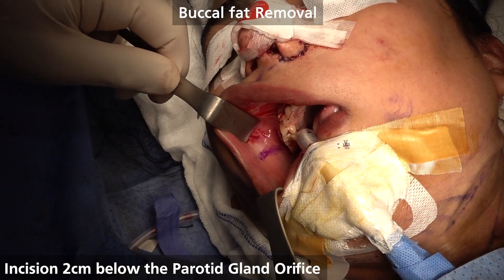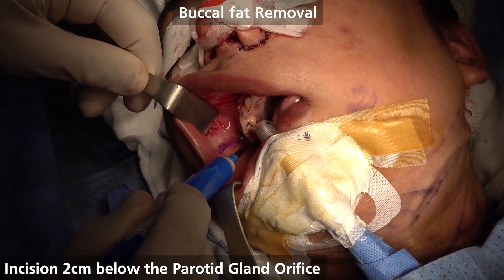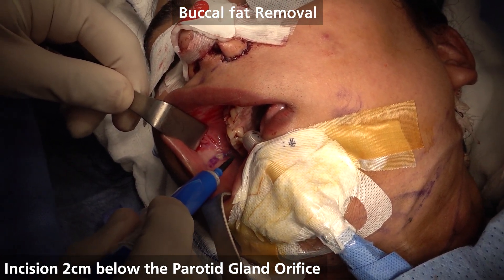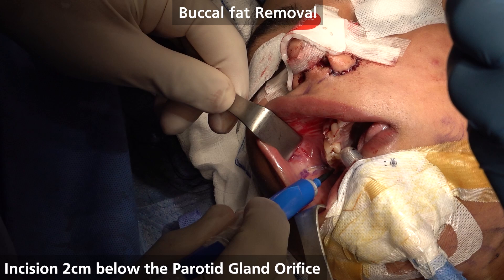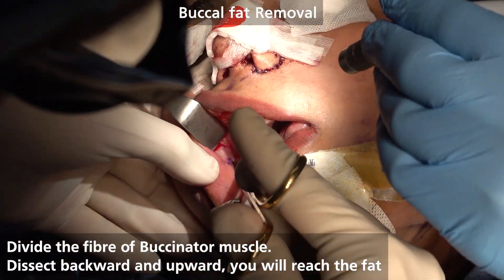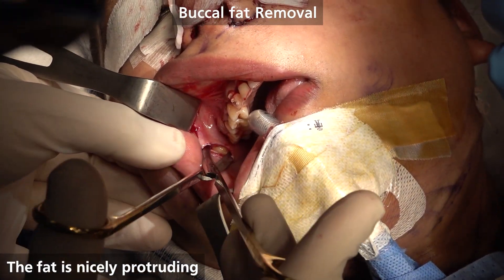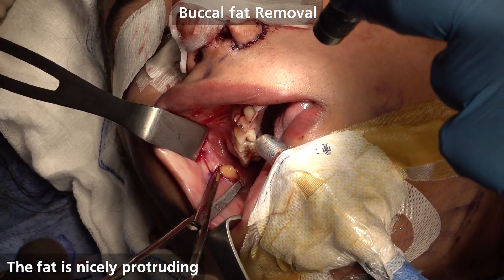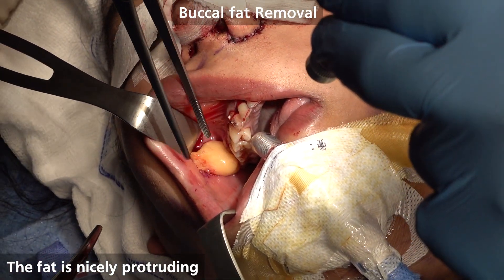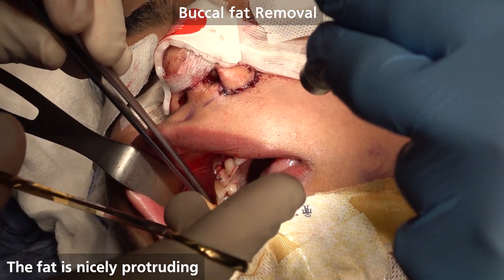We go in and see the tissue. I like the blades — so you know where the anatomy is now. You see how beautiful — in less than one minute, we get the fat out.